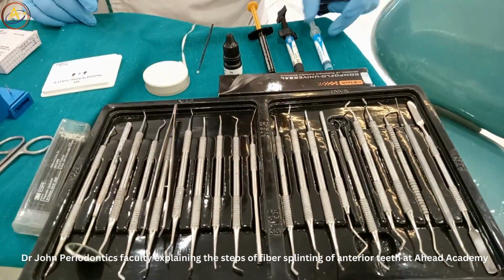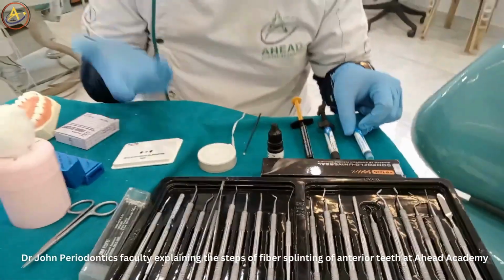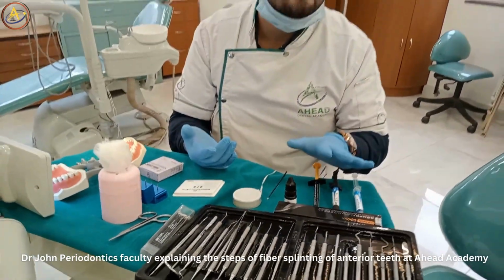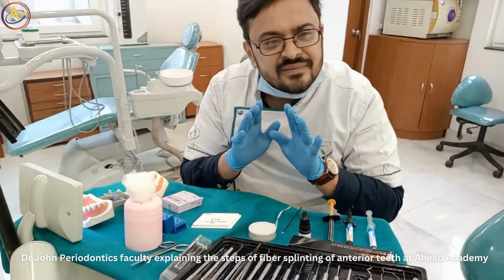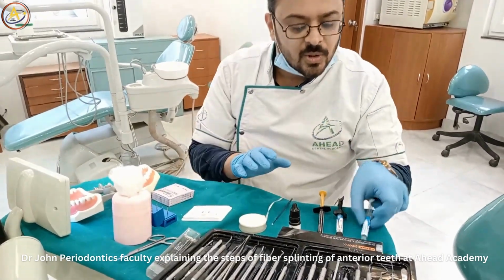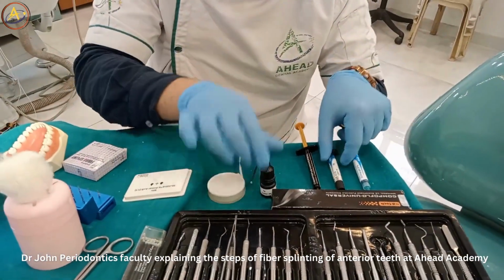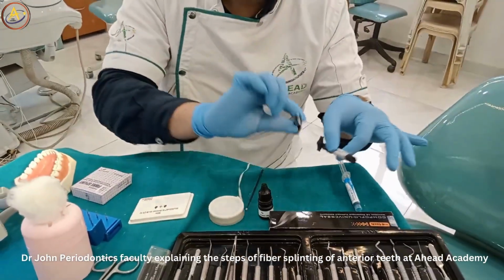Okay. Then you have this etchant. As you know, when you do splinting, you require some material to bond with. The best material to bond with is the composite. Splinting is never done with GIC. Splinting is always done with the composite. So for the composite, you have the etchant, you have the bonding agent, the most important, and you have the composite. This is the packable, this is the flowable.